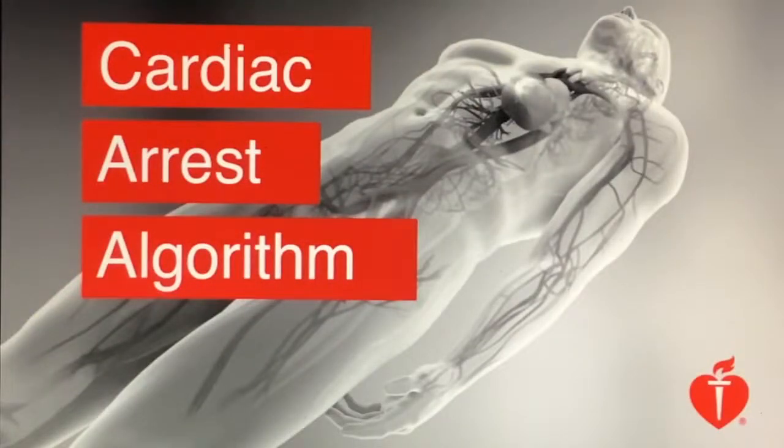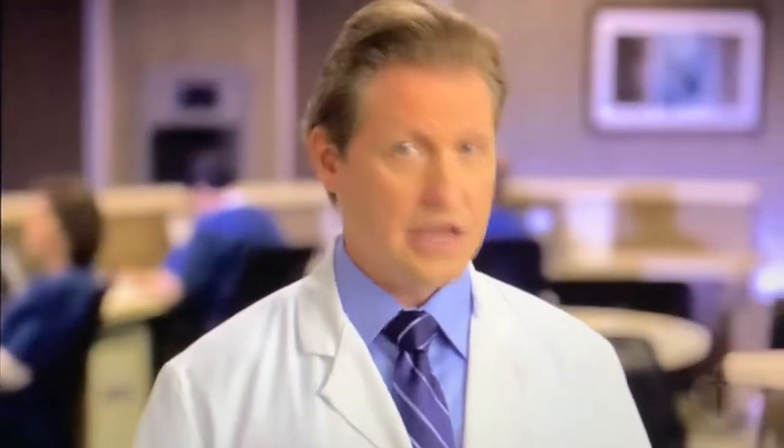The cardiac arrest algorithm is the most important algorithm to know for adult resuscitation. This algorithm outlines the steps for pulseless patients who don't initially respond to BLS interventions, including a first shock from an AED or manual defibrillator. Because many patients with sudden cardiac arrest demonstrate VF at some point in their arrest, it's likely that ACLS providers will frequently follow the left side of the cardiac arrest algorithm, which we'll do here.